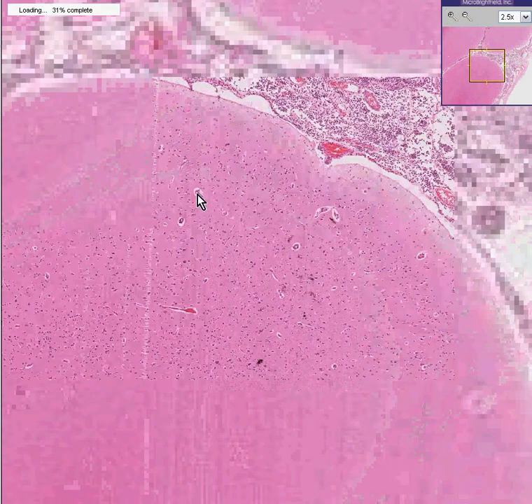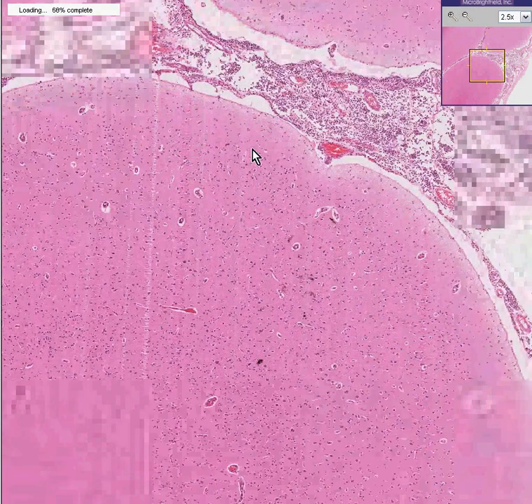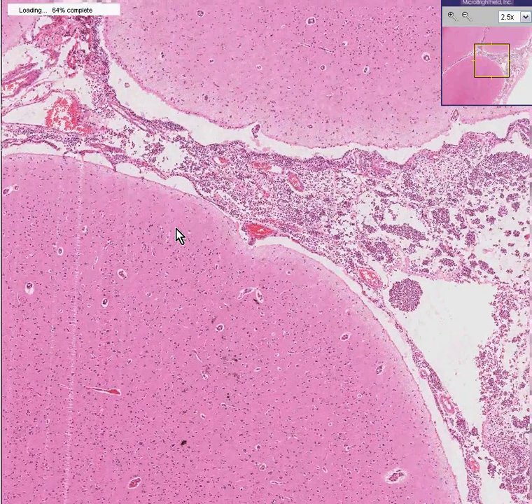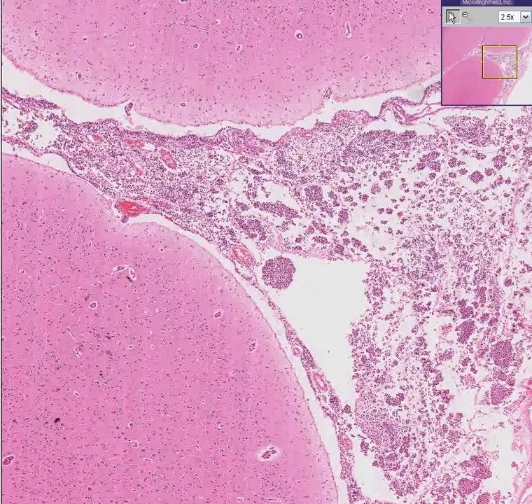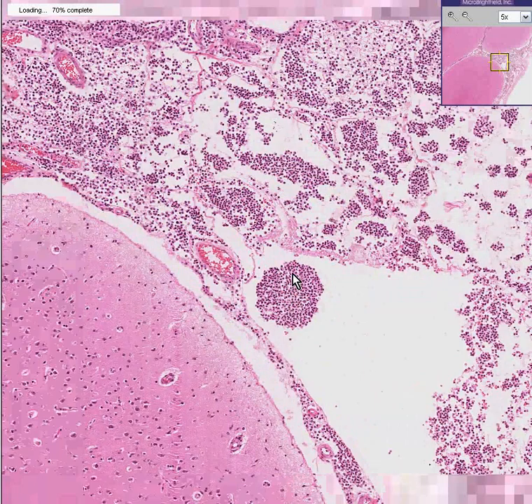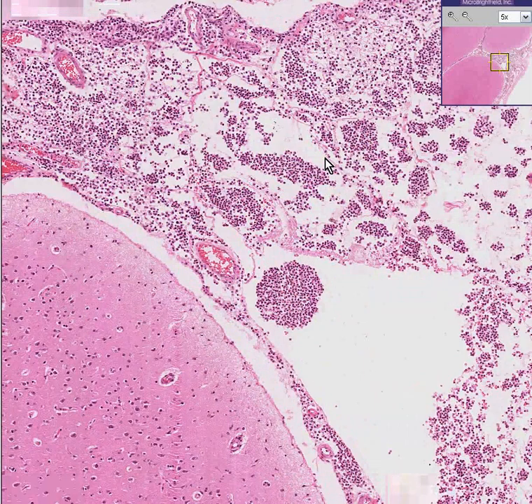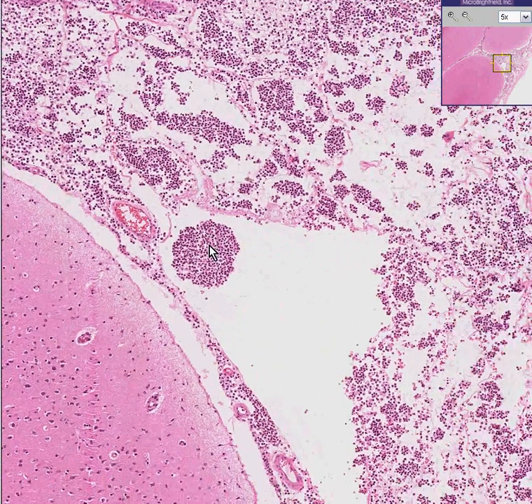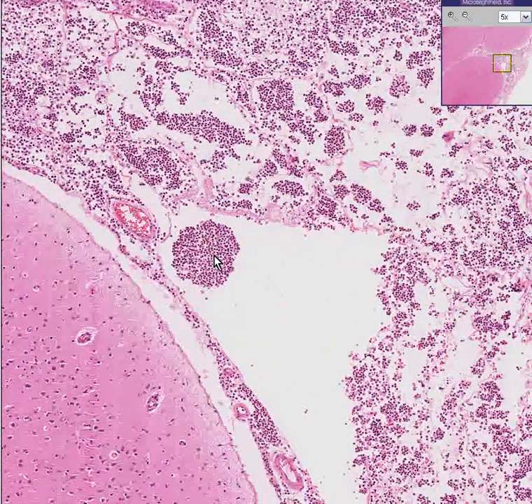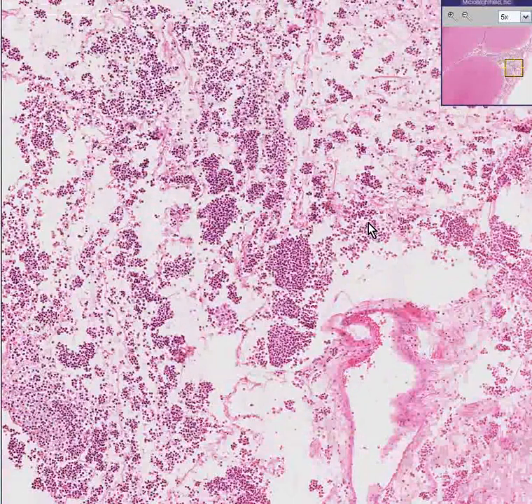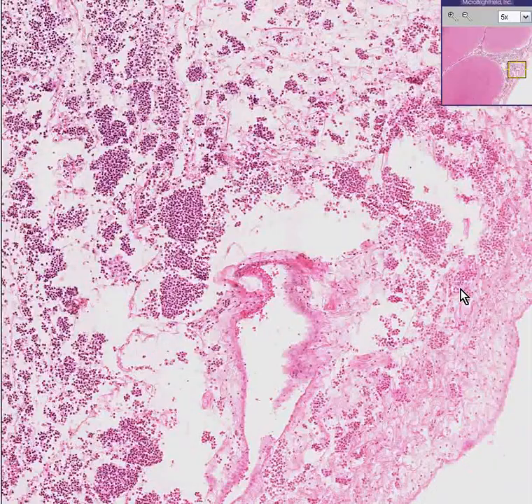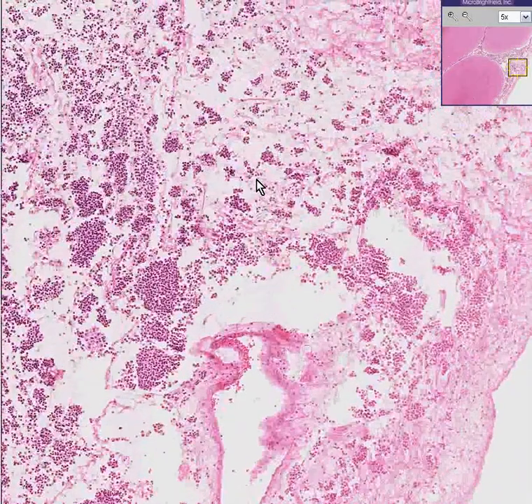But in this particular case, the brain is relatively normal and it's just the meninges that are very much inflamed. They are inflamed because they have these little collections of neutrophils all throughout the meninges. Here's a solid little ball of leukocytes — all of these are leukocytes. This is why the brain looked like pus and the meninges were thickened and cloudy.